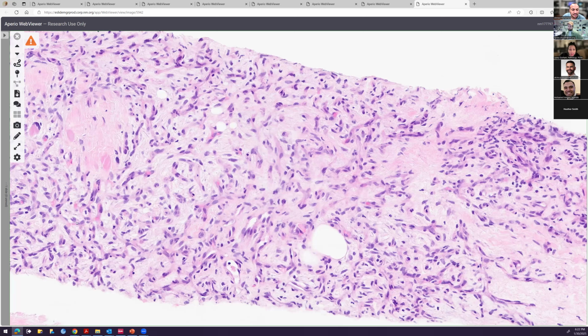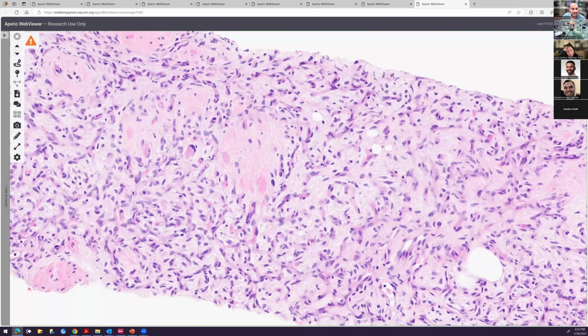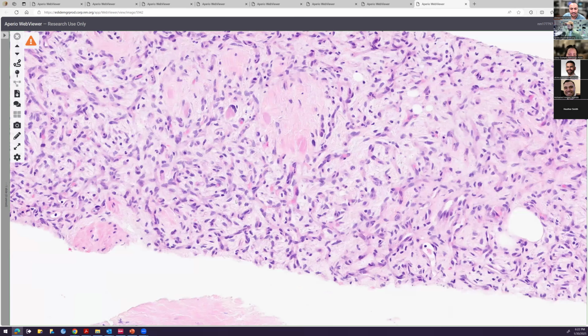It's kind of like chicken wire, or you can use arborizing, if you want to be as pretentious as possible, and I love doing that. But chicken wire, yeah, it's a very thin, delicate capillary vasculature running throughout this, right? It's very dense, honestly. That's very important, right? Okay, what else?